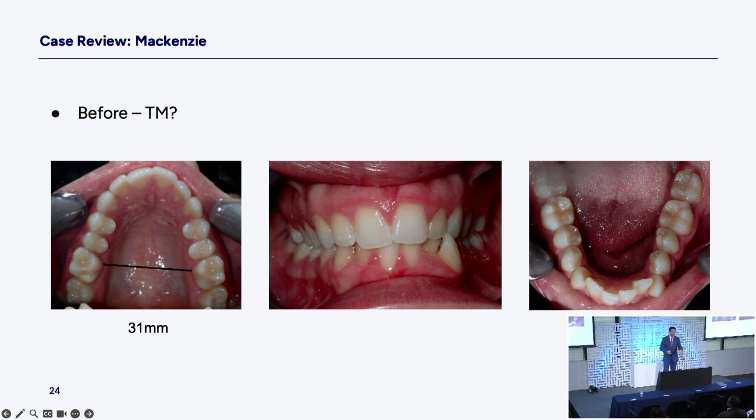And there we have our upper arch, narrow at 31, V-shaped, and then you see the lower. And you can see, oh yeah, the canines to canine, very crowded. In fact, just for fun, what if you just extracted number 22 and lined up the incisors? It might even fit. We don't want to take a canine out. Let's take an incisor out. Pop an incisor out of there, we'll line up the rest of the teeth. It could probably work, but take a look at the back teeth, how they're leaning in. So extracting a lower incisor, that's a bad choice going forward.